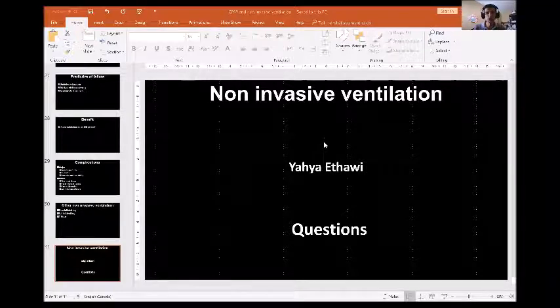Do you mean IPAP? I don't know what that means. In CPAP, you cannot control PEEP. CPAP is different from PEEP. There is no PEEP in CPAP. Whoever told you that there is PEEP, there is no PEEP. There is EPAP, or the pressure during expiration. PEEP is inside the alveoli. It's only in the ventilator that you can provide PEEP. And in the ventilator, there are two PEEPs: the PEEP that you provide and the effective PEEP inside, which they call IPEEP. CPAP is not PEEP. You cannot provide or control PEEP.